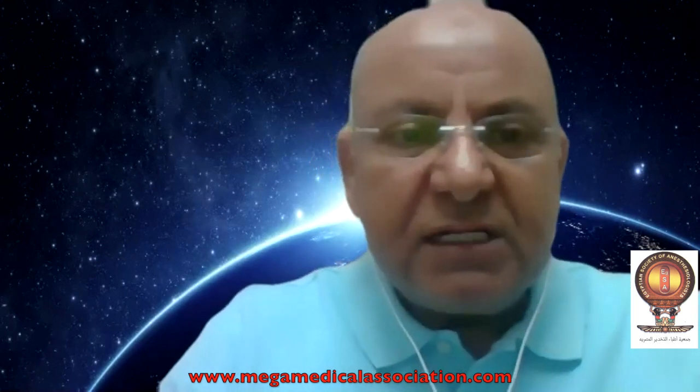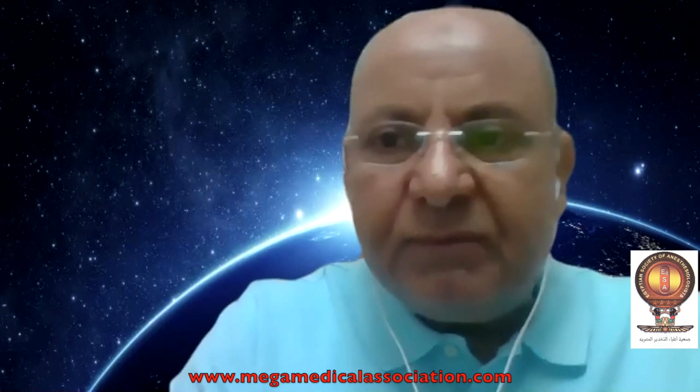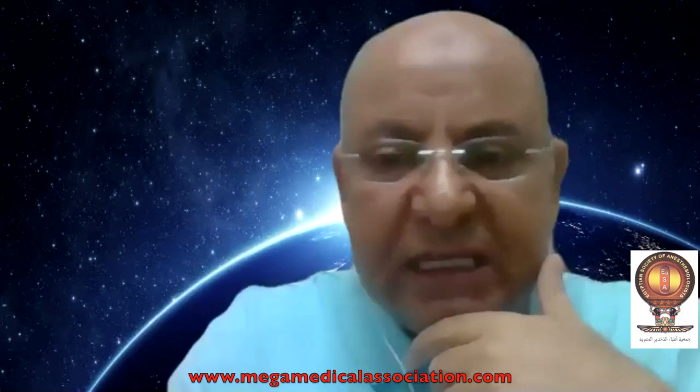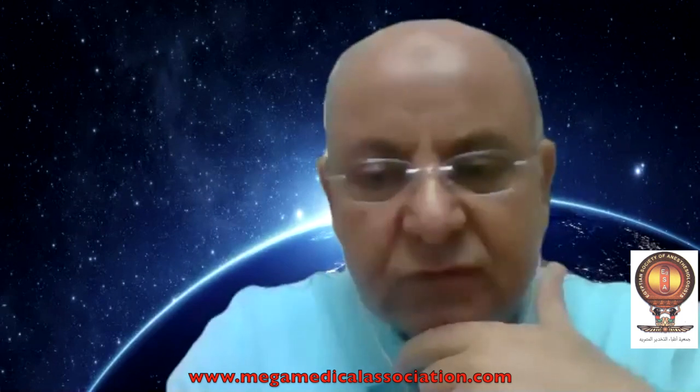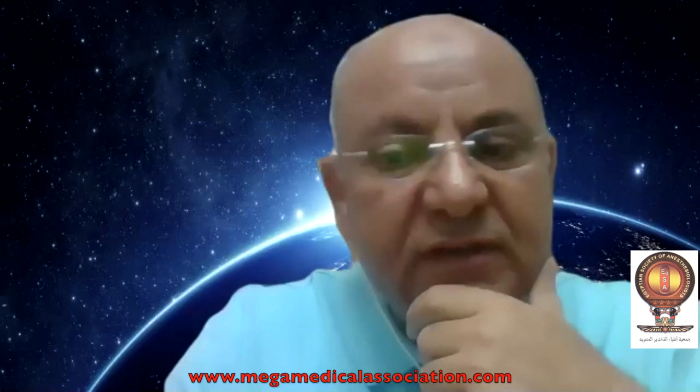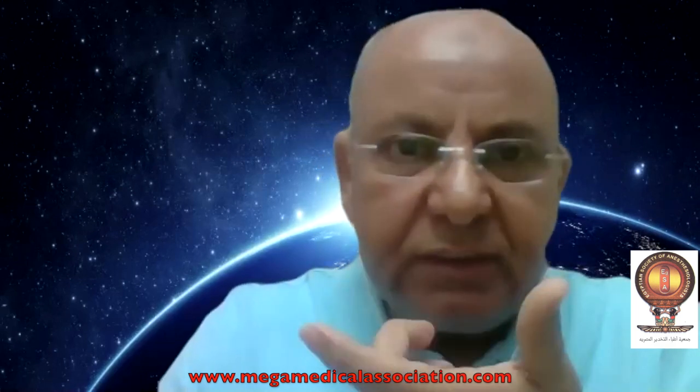A pacemaker is a device with a generator and leads inserted in the endocardium, in either one or two chambers. If a lead passes through the coronary sinus to the left ventricle, it's called cardiac resynchronization therapy or a biventricular device.